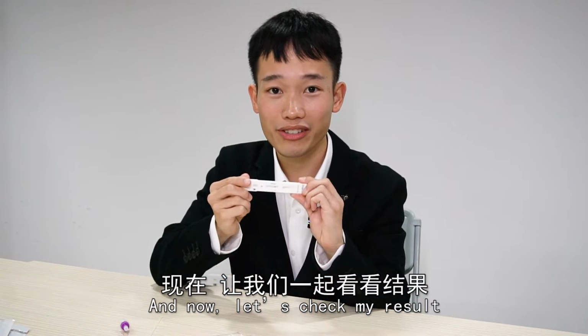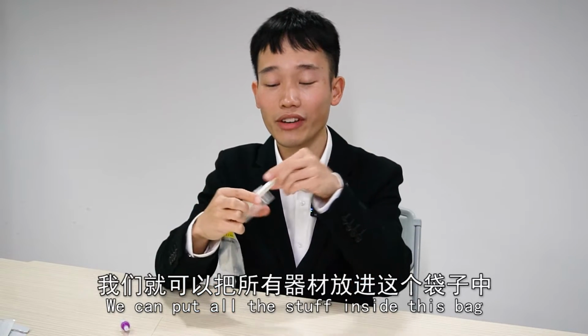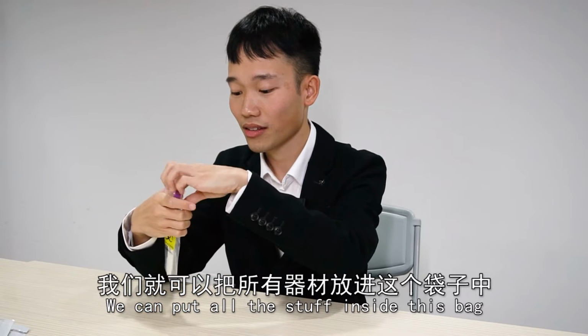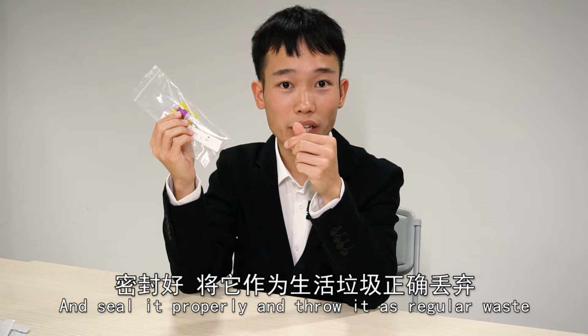And now let's check my result. 1 line means negative. Then we can put all the stuff inside this bag and seal it properly. Throw it as regular waste.